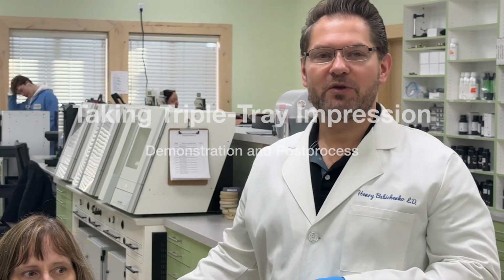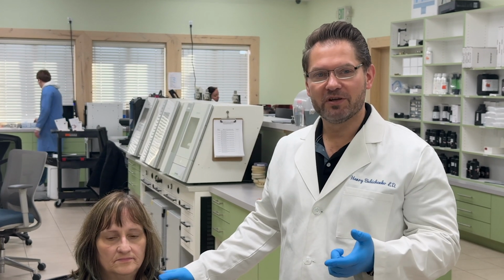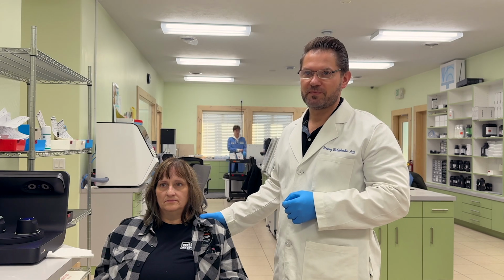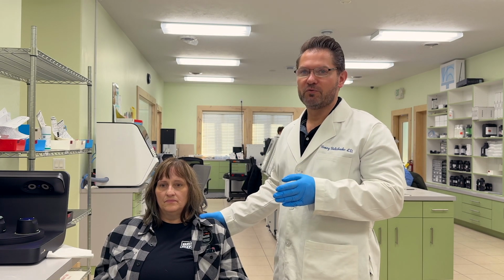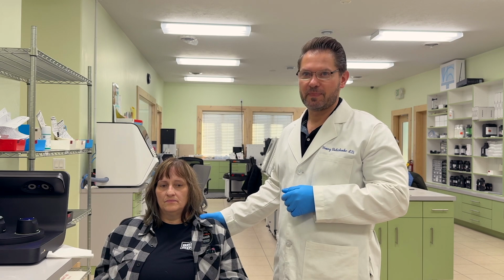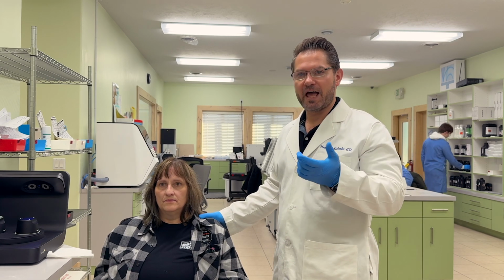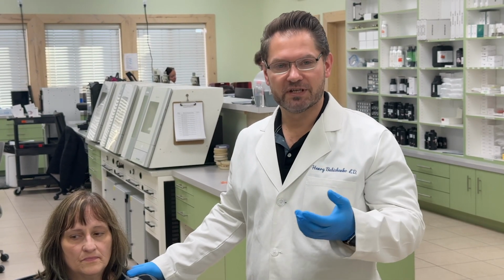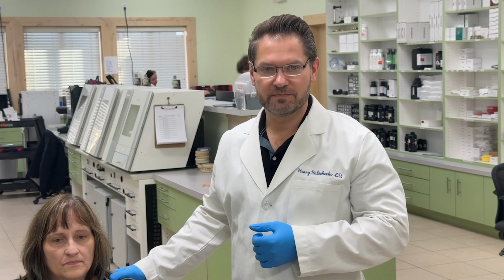Hi, today we're going to start a new set of dentures, upper and lower dentures. But today we're going to use a digital method of manufacturing dentures. There's also a different workflow when it comes to taking impressions. First workflow is taking regular analog impressions. Second workflow can be using an oral scanner to take a digital impression.